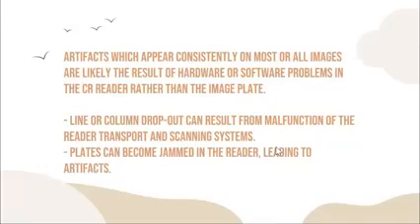Dust particles sticking to the oscillating flat mirror, the rotating polygonal mirror, or the light guides in the reader can cause pixel dropout. So, dapat limpyuhan ninyo. Okay? Kung dili man siya malimpyuhan, professional help should be acquired. Over time, the laser itself will need replacing due to loss of power. So, dili man siya all the time na okay ang yung laser. There will be time na ma-replace siya, most especially kung dugay na siya nagamit.